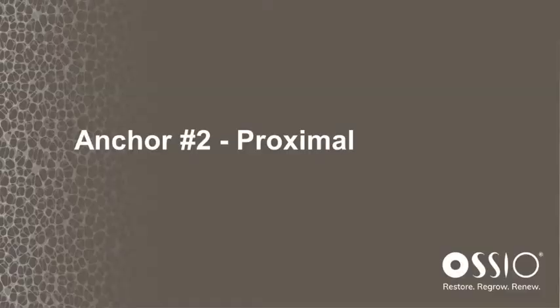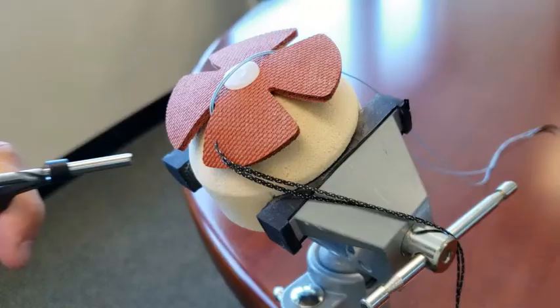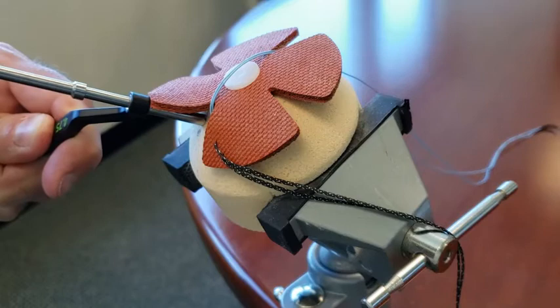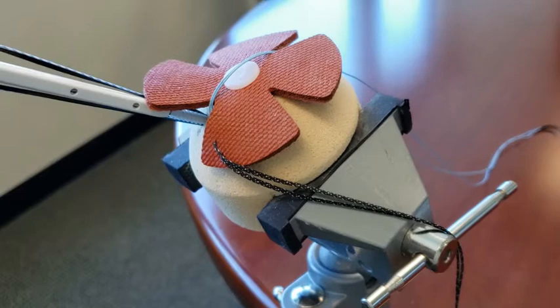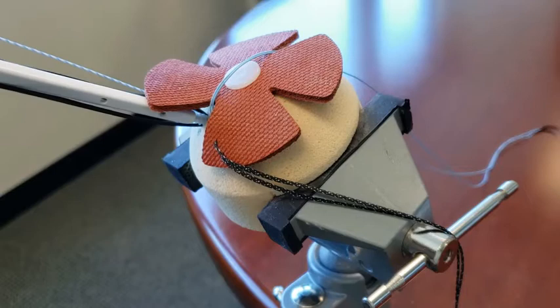We're going to place the second proximal anchor in the same manner as the first one. You're going to utilize the drill and drill guide, drilling to the positive stop just underneath the tendon. Next you'll take the distal end of the eyelet, insert it into the pilot hole, mallet down so the first couple of threads engage, then turn the knob until the white inserter reaches the surface of the bone.